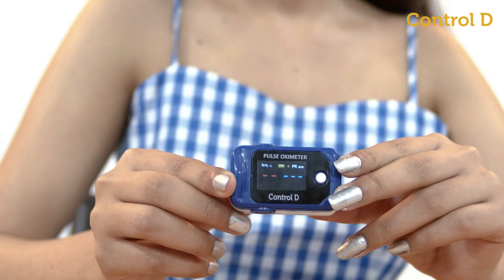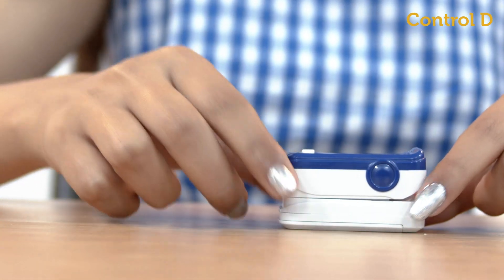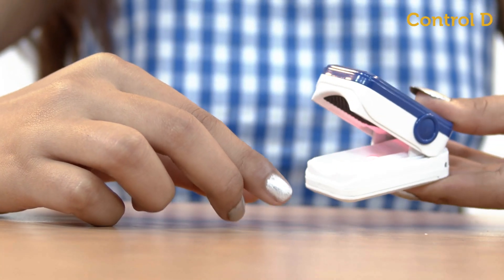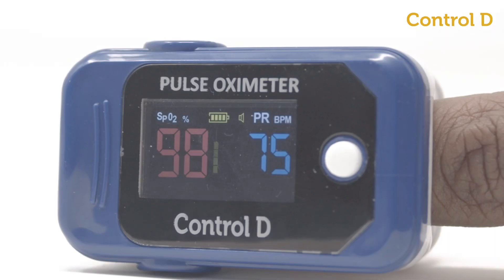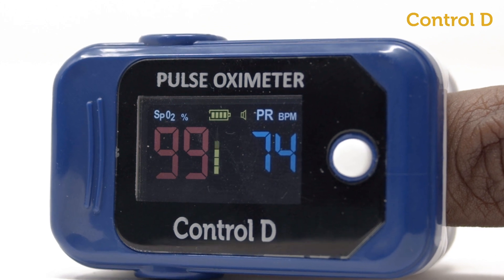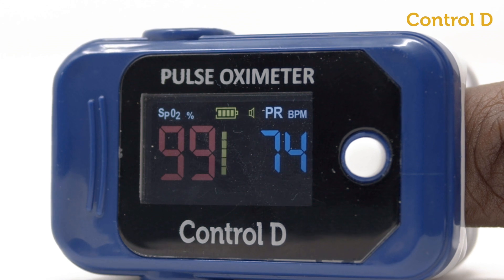To use, switch on the pulse oximeter by pressing the on button — a red light will be seen inside the device. Slide your finger into the opening until it touches the end. After a few beeps, the oximeter will display SpO2 in red, the pulse bar in yellow, and the pulse rate value in blue.